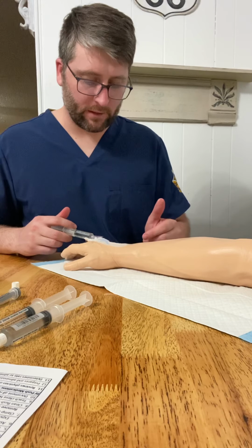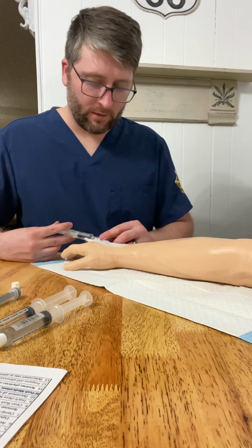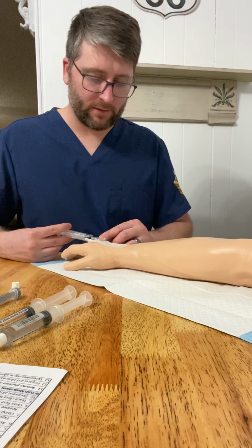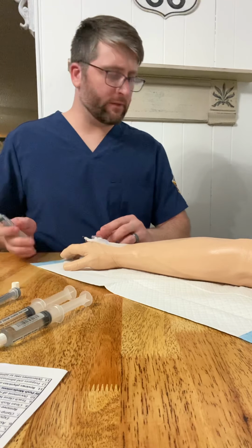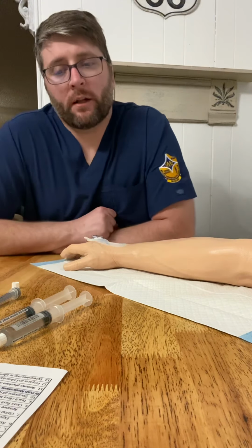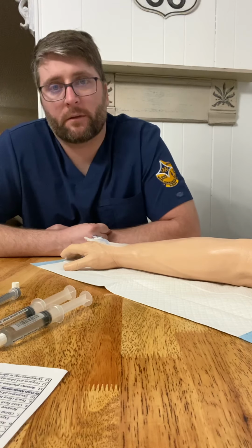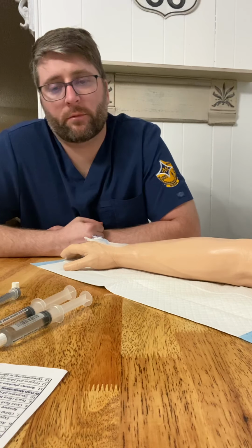We also explained why we are going to be leaving this IV in for the time. We still want the access, but we don't need the continuous running of the IV at this time. So I'm just going to leave it just like that, and then we're going to educate the patient on how to take care of the lock, and then we're going to document all relevant information.